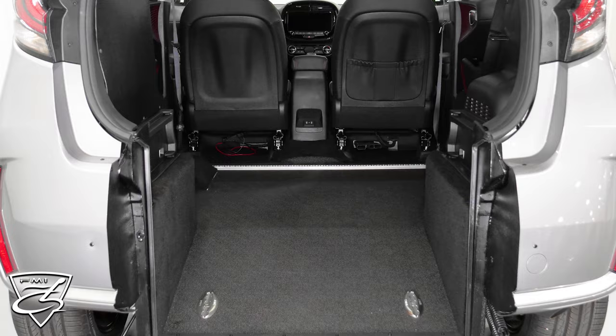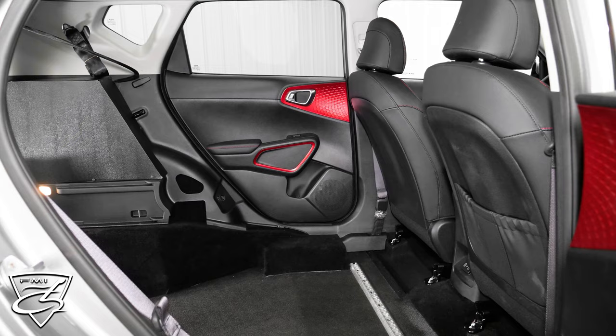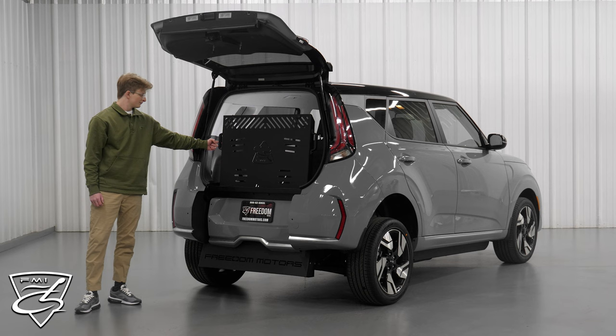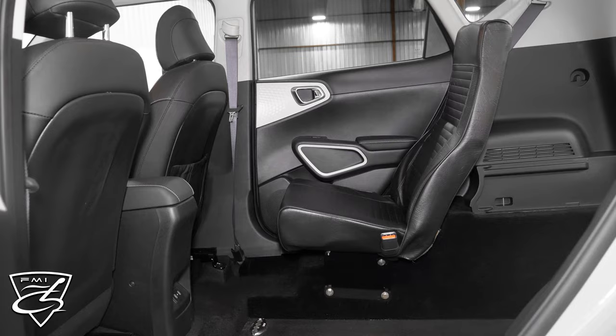We also offer the standard and deep floor Kia Soul models. The standard model is the same one shown here but without the power transfer seat. The deep floor model can be paired with a manual rear entry ramp that is spring-assisted for easy lifting and lowering. This model can also be fitted to hold an additional ambulatory passenger with our bucket seat in the back.